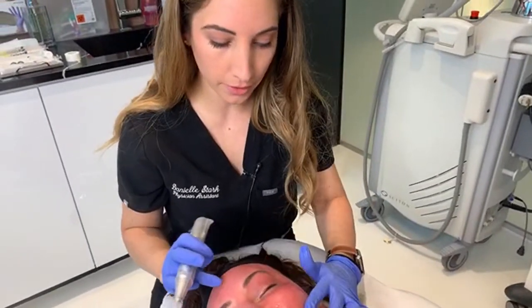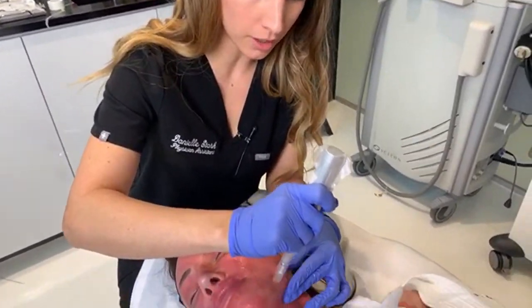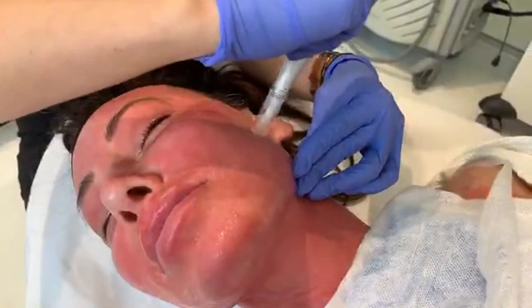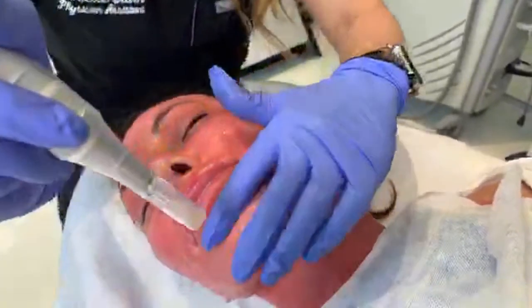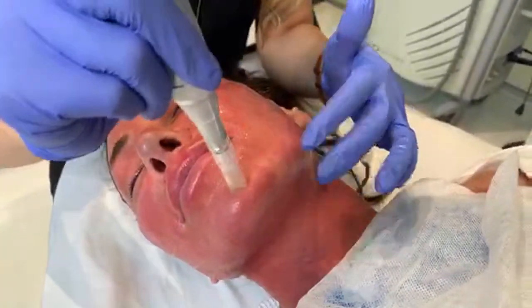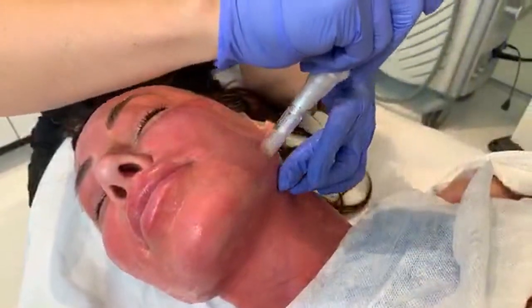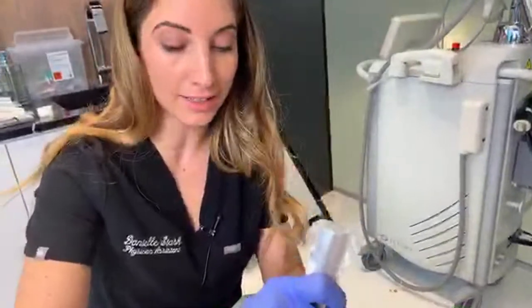Bring your hip to the right for me. So you can see that she's not bleeding. We're not doing a super deep microneedling treatment. If we were doing this alone, we would be adjusting the depth for different areas. There's a lot that goes into these treatments. So in different areas of the face, of course, there's different amounts of fat. The skin is at variable thickness. It's important to adjust what you're using for different areas.